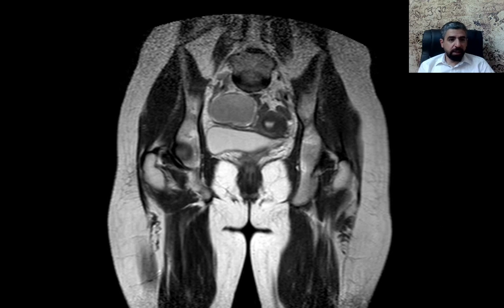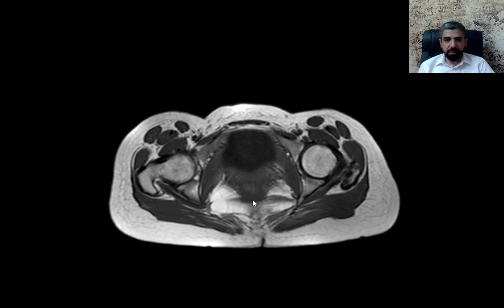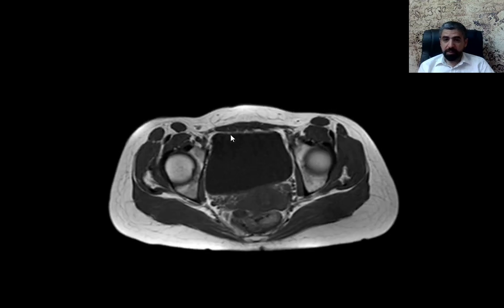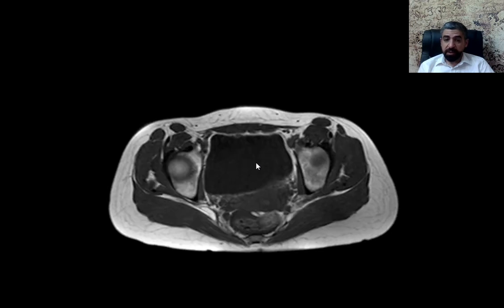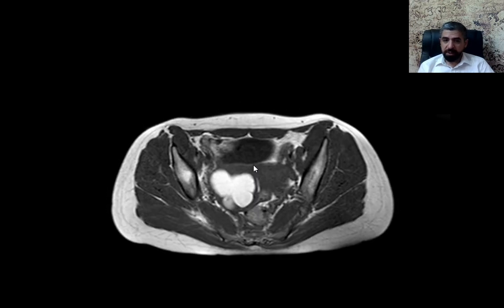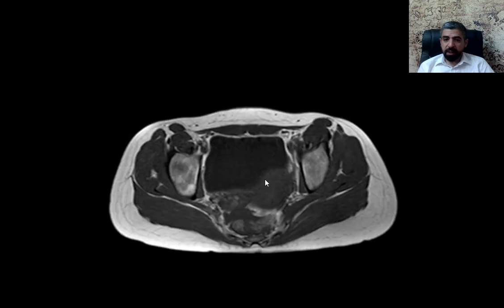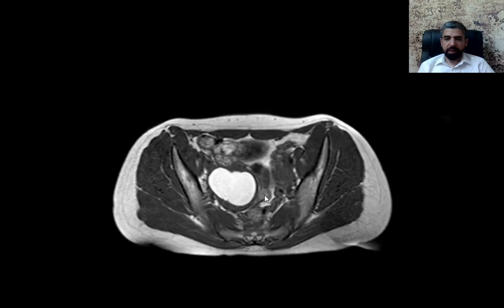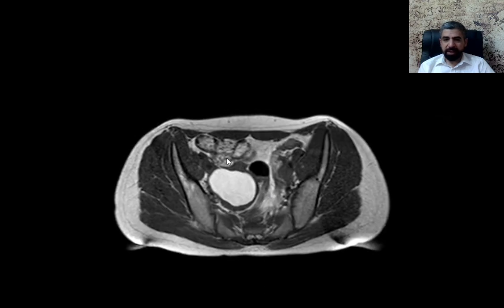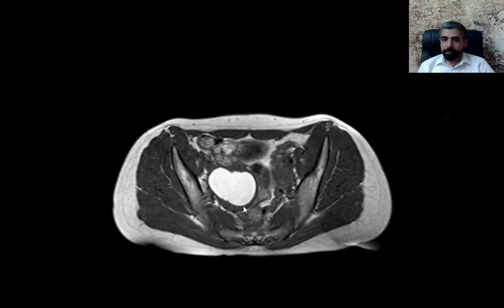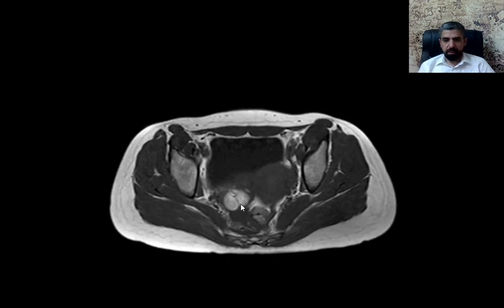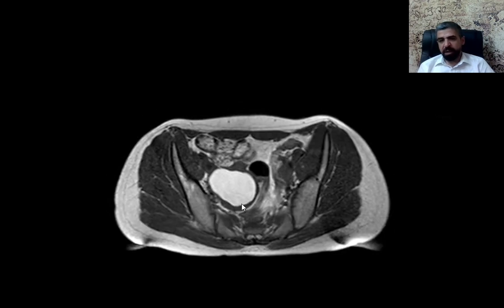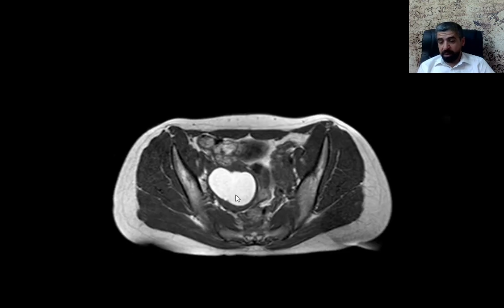Now let's look at the T1-weighted images. This is the axial T1-weighted image — you can see the urine in the urinary bladder is dark, because fluid is dark on T1-weighted images. And you can see this is the lesion we discussed on the T2-weighted images. It is hyperintense — it's bright.